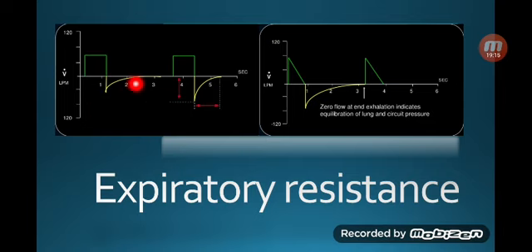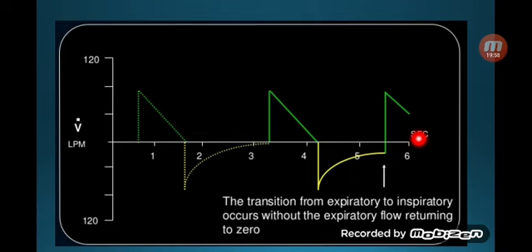So what is PEEP? PEEP is the positive end-expiratory pressure. So you're deliberately keeping some pressure, some minimal flow, some air going to the lung in the background, not related to breath, to keep the lungs minimally open, to make it easier for the next breath to inflate without a lot of resistance, right?